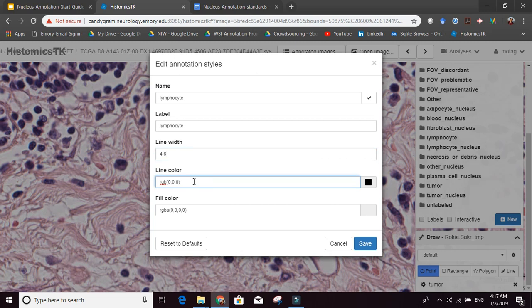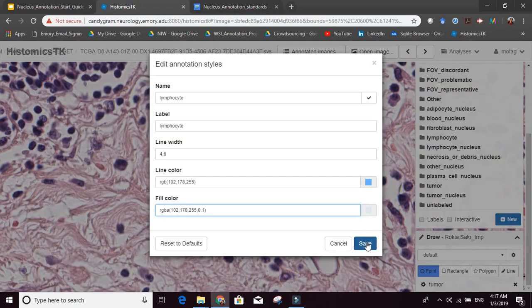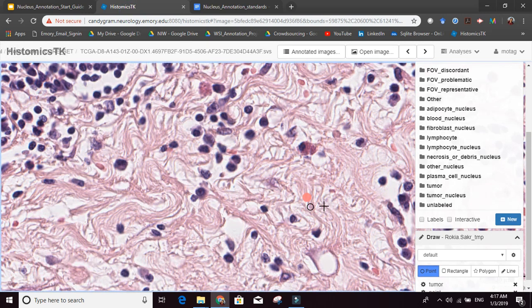Okay, sorry, this is the line color, and this is the fill color, and 0.1, and this is RGBA instead of RGB. So basically, you just copy it from here. Okay, and you click OK, and then you place one dot.